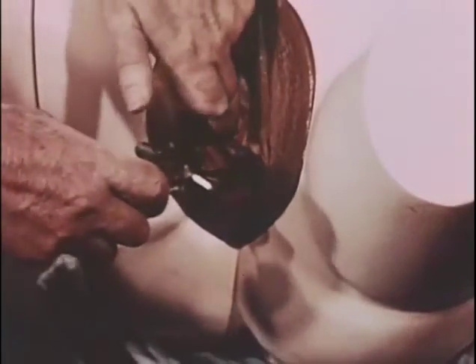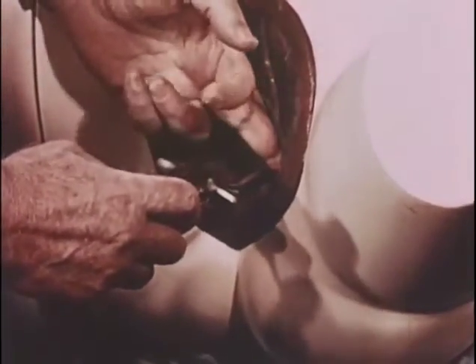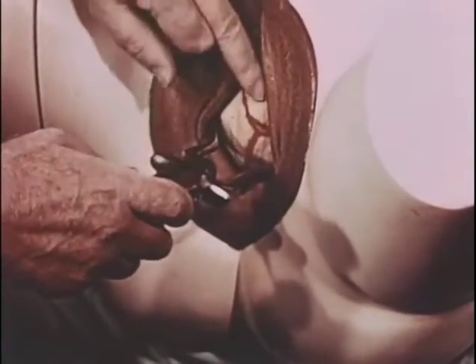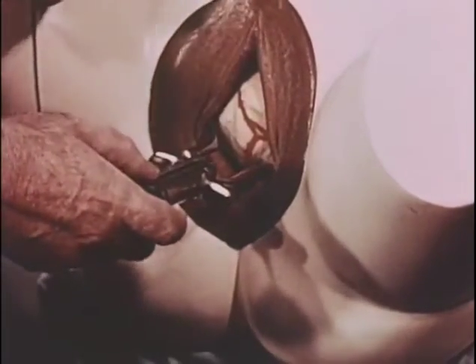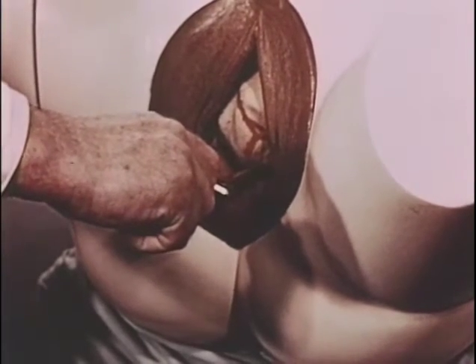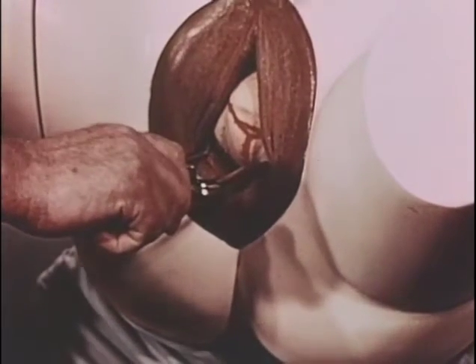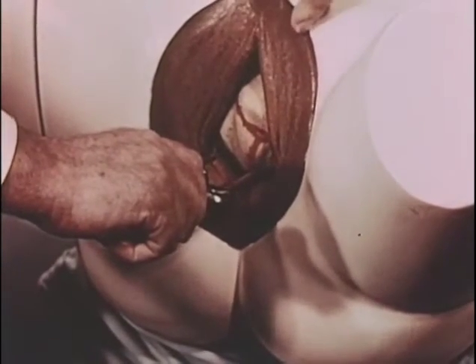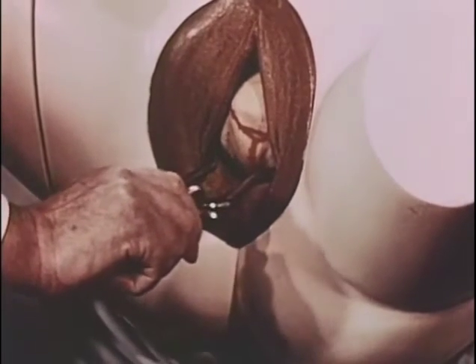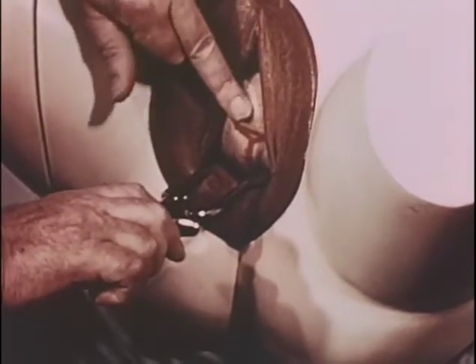Finally, the fenestration is barely felt, if at all, in advance of the head. With those three checks satisfied, one is ready for rotation. And the rotation is carried on the axis of the shanks, slight compression of the handle, and if the occiput is already at 12 o'clock, the rotation isn't necessary. If it's at 1 o'clock, then it's a short arc from 1 to 12 with depression of the handles at the completion of the rotation.